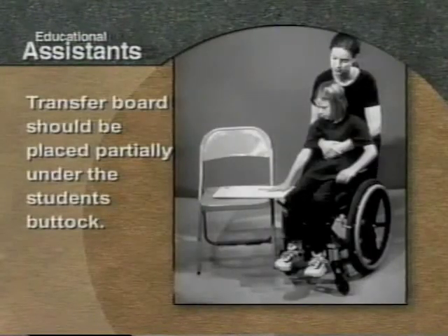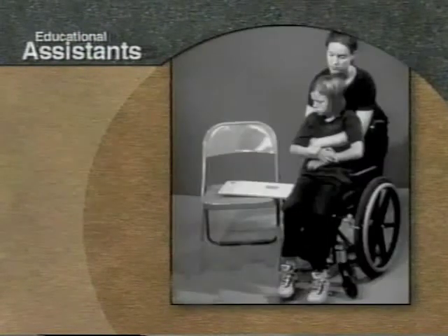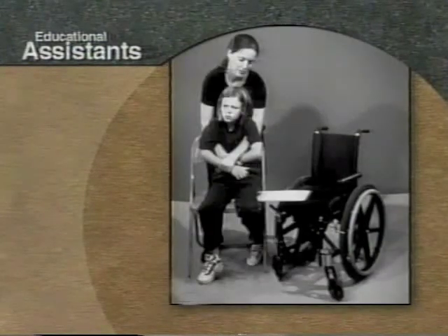Note that during this transfer, the educational assistant positions the transfer board partially under the student's buttock so that the board is used to bridge the gap between the wheelchair and the other chair. Notice how the educational assistant slides the student across the board to the chair.